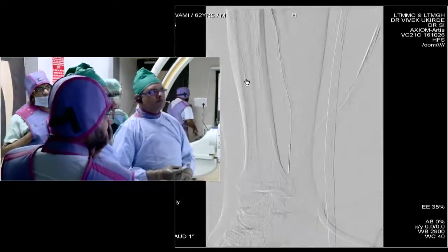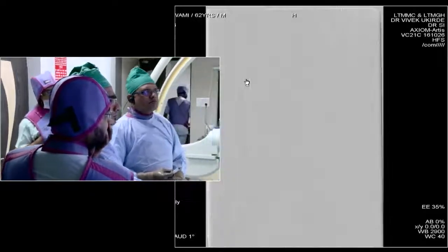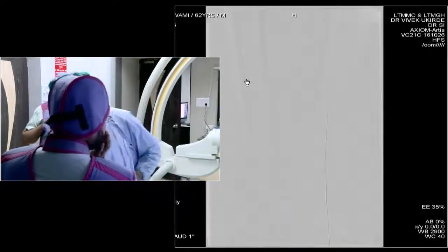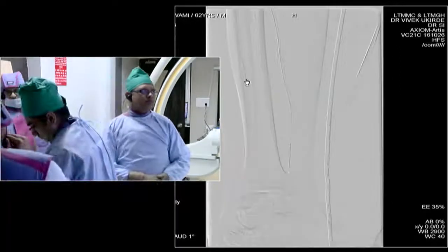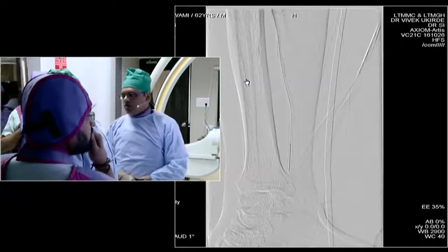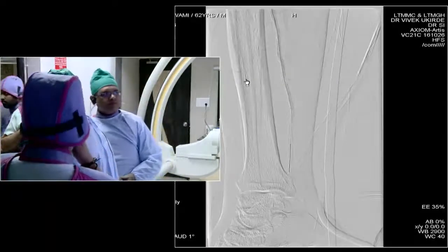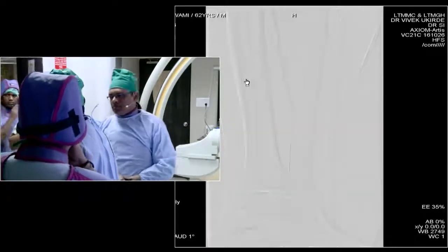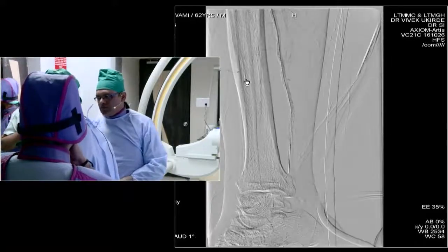I need to let the nimodipine run for some time. Obtura is a Meril product — it's a very simple, very effective closure device; we'll show that during the presentation.